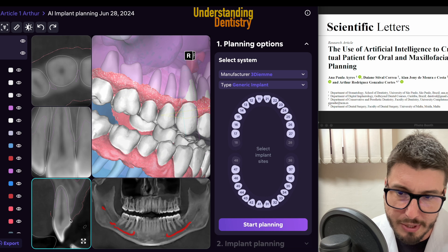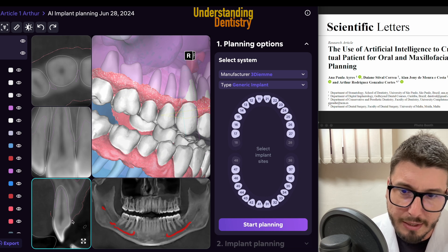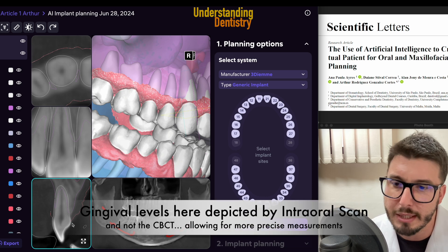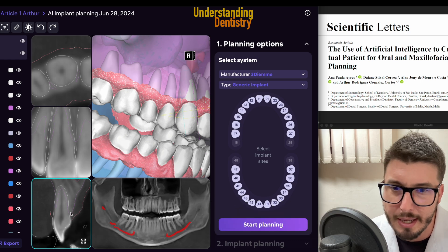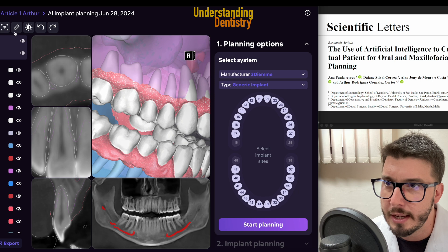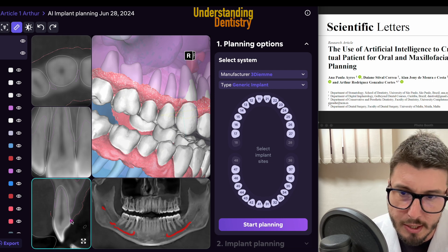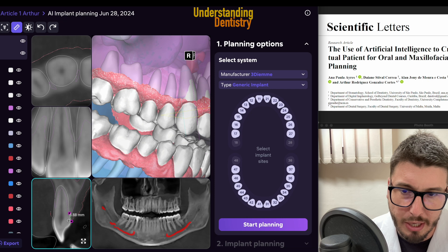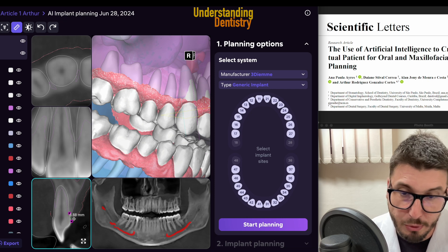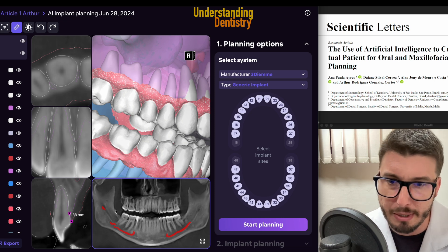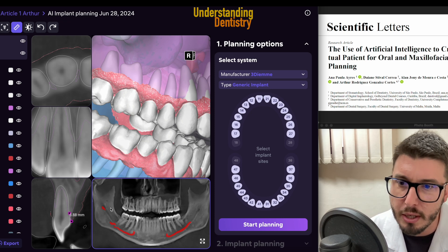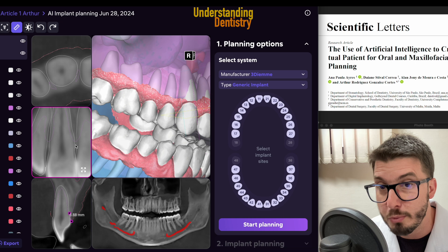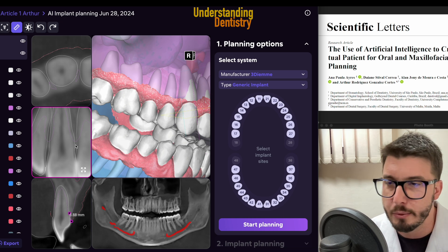Therefore we have information about the biological width. This is the limit of the soft tissue and this is the limit of the bone tissue — the marginal bone of this tooth. For example, we are on the side of the canine here. I can even measure if I want. So we have about four millimeters of this measurement, which is proportional to the biological width — we are talking about limits of soft tissue and bone tissue.